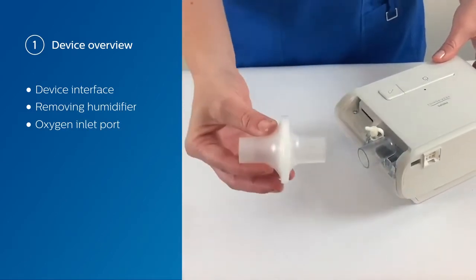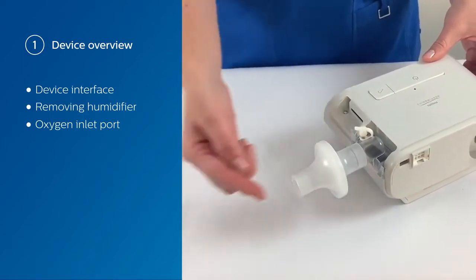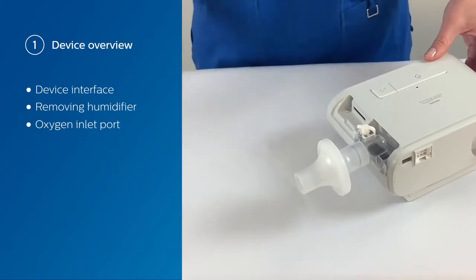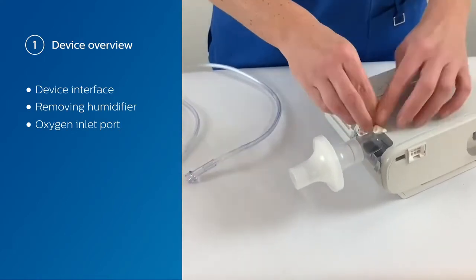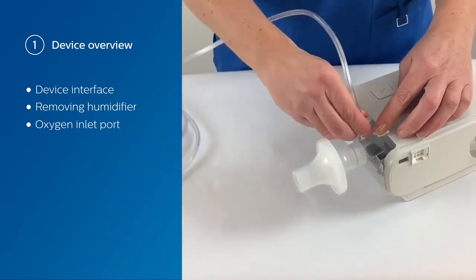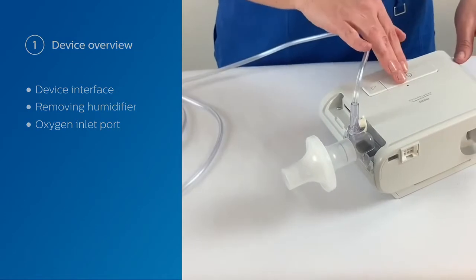We want to add a bacteria viral filter onto the end here because this is going to be your air inlet. Then remove the cap or just open it and you can connect your oxygen tubing. Make sure to not turn your oxygen on until the device itself has been turned on.